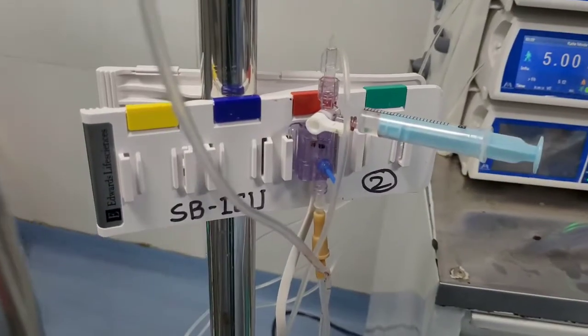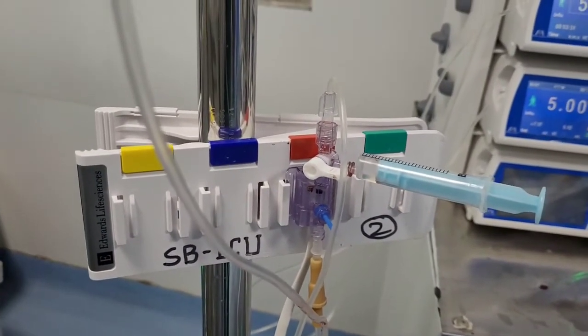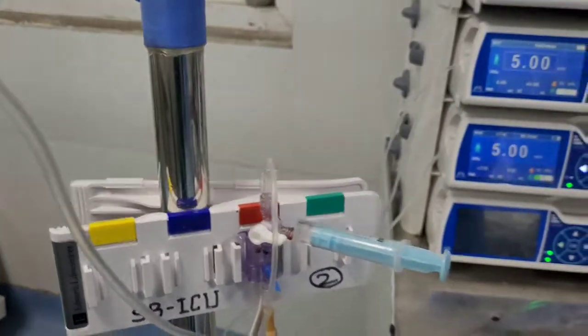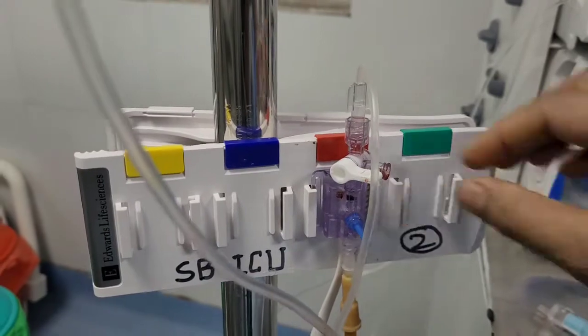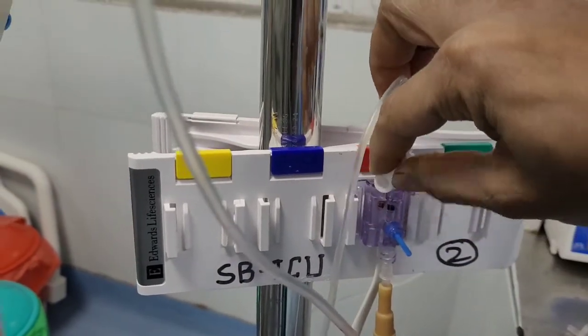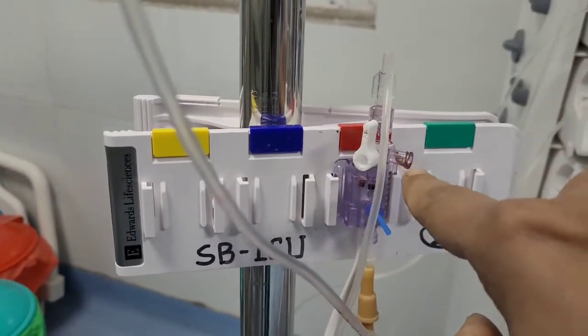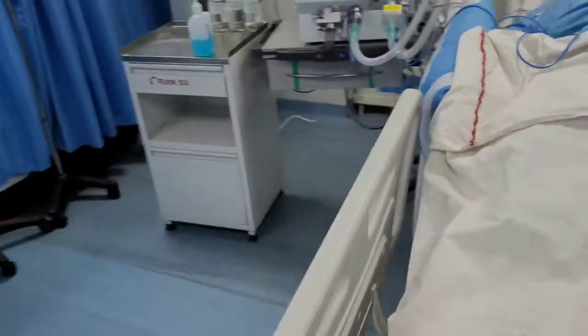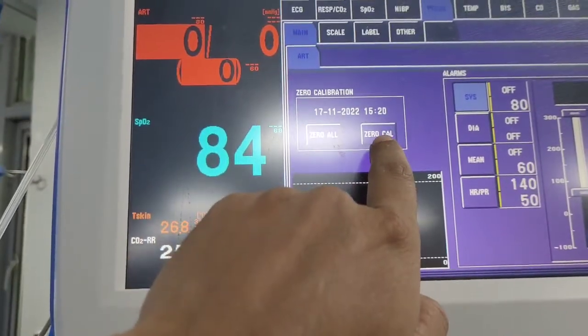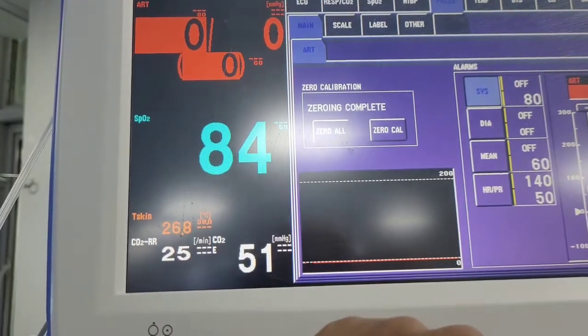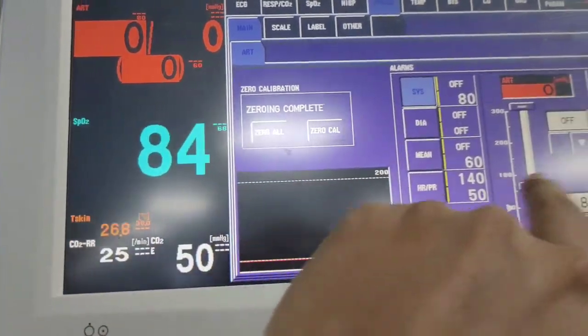Now I will show you how to calibrate and zero this arterial line. For this we have to take out the syringe, turn this upside, and keep this port open. Now we go into the arterial menu and select zero calibration. Zero complete.